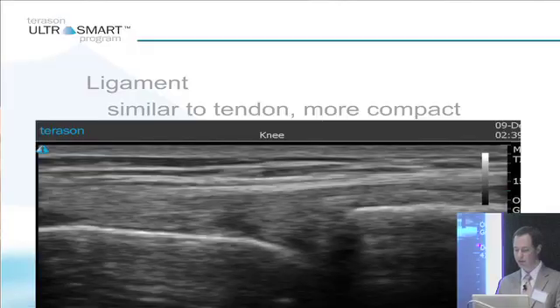Ligament is going to be very similar to tendon in so far as it's dense. Here's a medial collateral ligament — it's dense, but it's even more compact than tendon is. You can see these fibers running parallel.